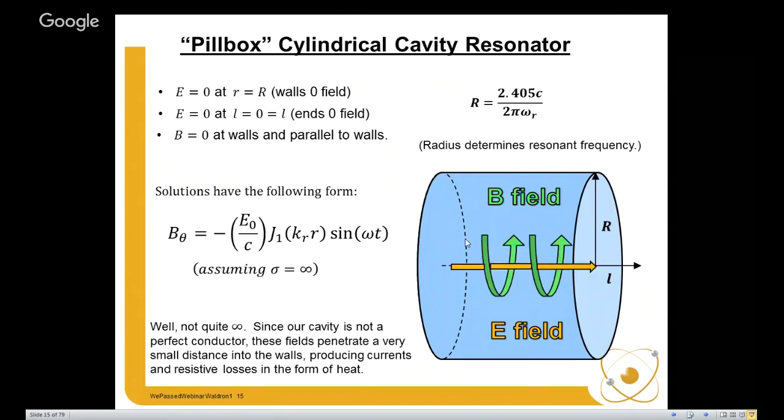or resonance. And when we do get that, what we're going to get is electric fields oriented left and right, surrounded by alternating magnetic fields, which are circular in their behavior. Now, this will be very handy if we wish to accelerate electrons along the axis of this structure, and of course, that's what we're getting at.